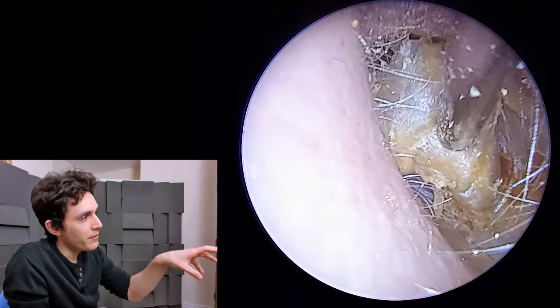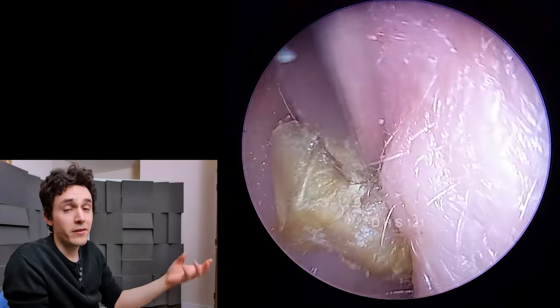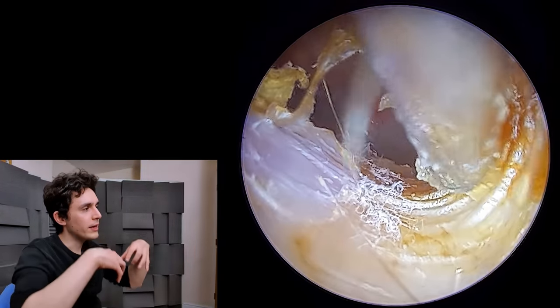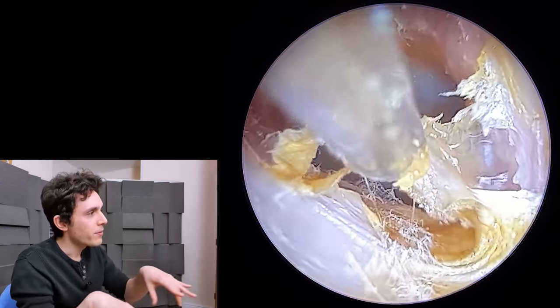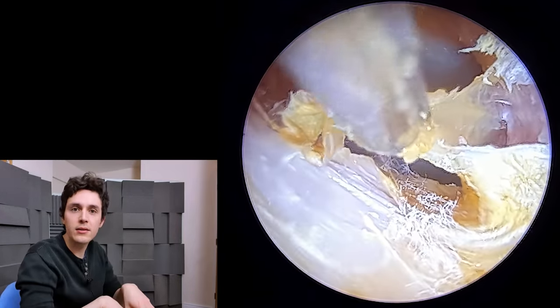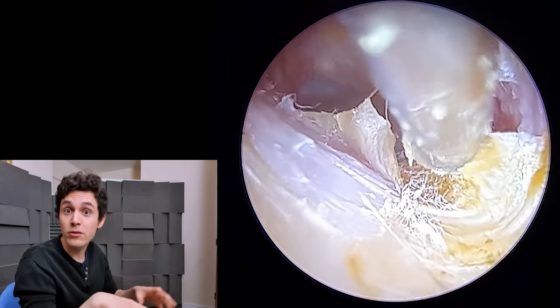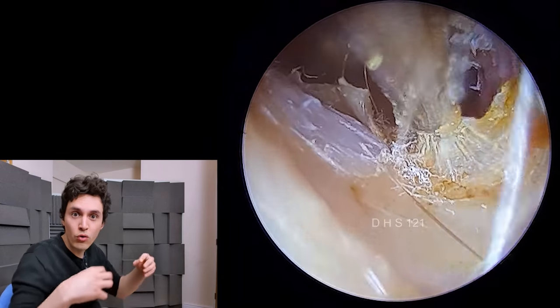In this particular case, this fungus — there we go, final extraction there — just like the fungus you would find on a tree or growing on spoiled bread like moldy bread, this fungus is basically growing into dead stuff. The mycelium of the fungus, which is like the webby kind of bed of the fungus, grows into dead things. What's happening is that network of very fine hairs is growing into the food source and then secreting digestive molecules, digestive enzymes — like chemicals — which breaks down the thing that it's feeding on. Then it can be absorbed into the network of hairs.